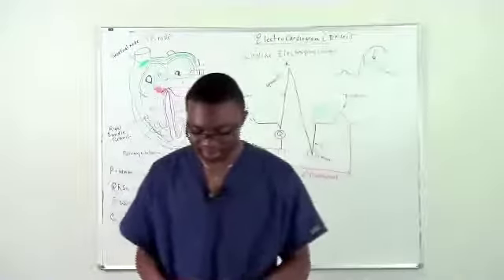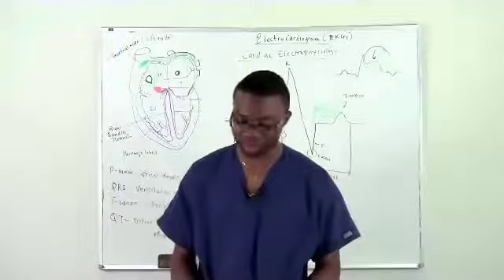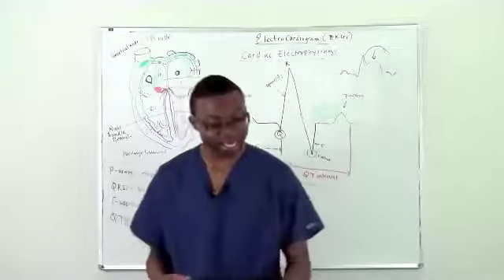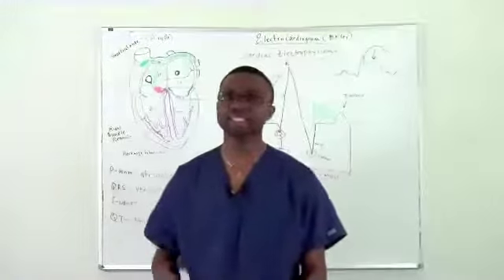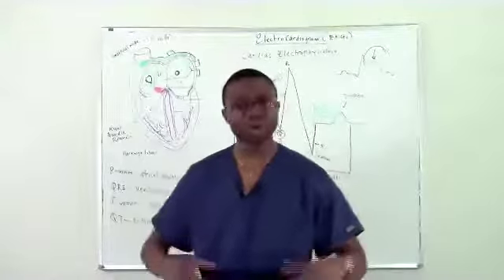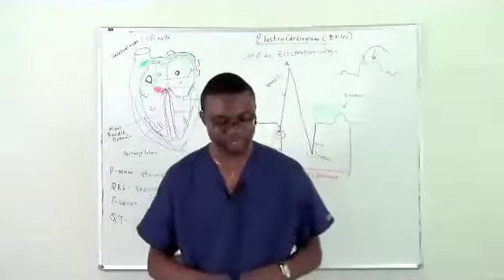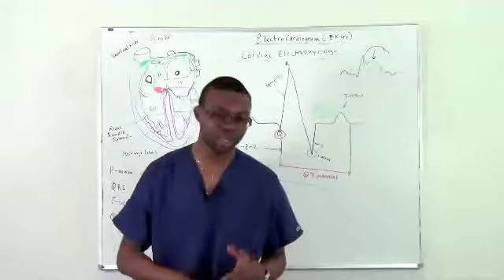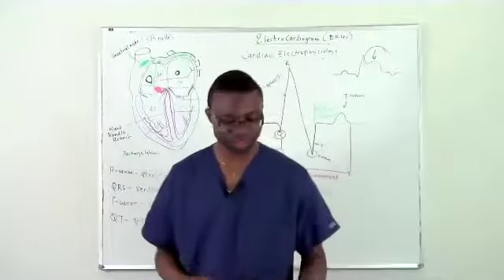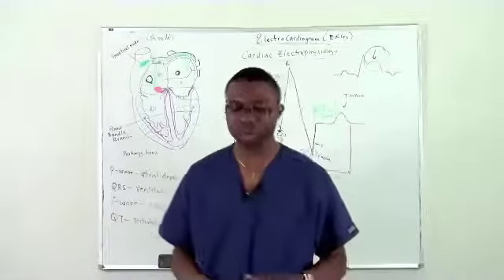What we're going to do next is now focus solely on cardiac electrocardiograms and figure out how we approach reading EKGs. This is a very challenging topic for students when they're approaching it: how do I read an EKG? How do I approach this? What do I need to know? I'm going to go over that in more full detail when we talk about the P waves, the PR intervals, QRS complexes, ST segments, T waves, QT intervals, and even U waves later on. And we're going to talk about EKG leads and also axis.